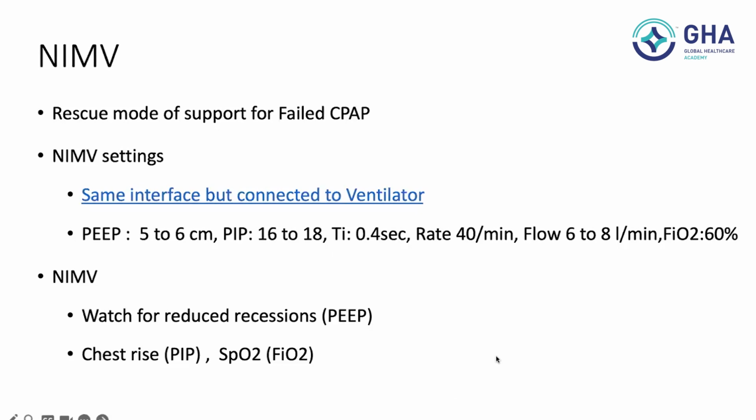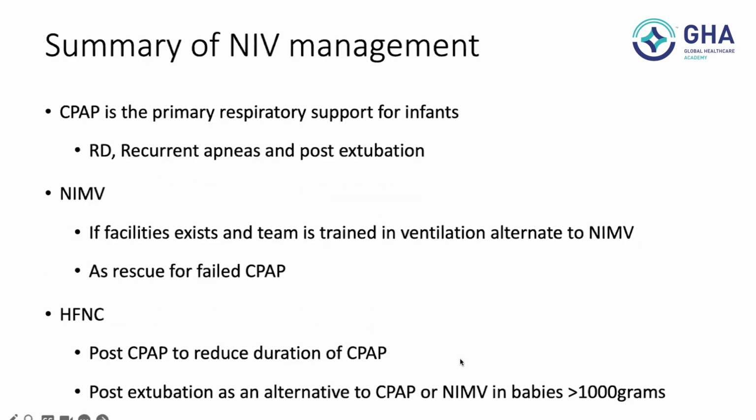But again, you have to ensure that your CPAP is delivered properly. So for that, you think of flow, bubbles, FiO2, saturation, pressure, bubble seen, and bubble heard. Your interface should be appropriate. Baby should not have any pain. There should be cocooning, nesting, and developmental supportive care given, and prevent nasal injury. Always have an orogastric tube in place and feed the baby. The babies are much quieter if you start feeding them early.